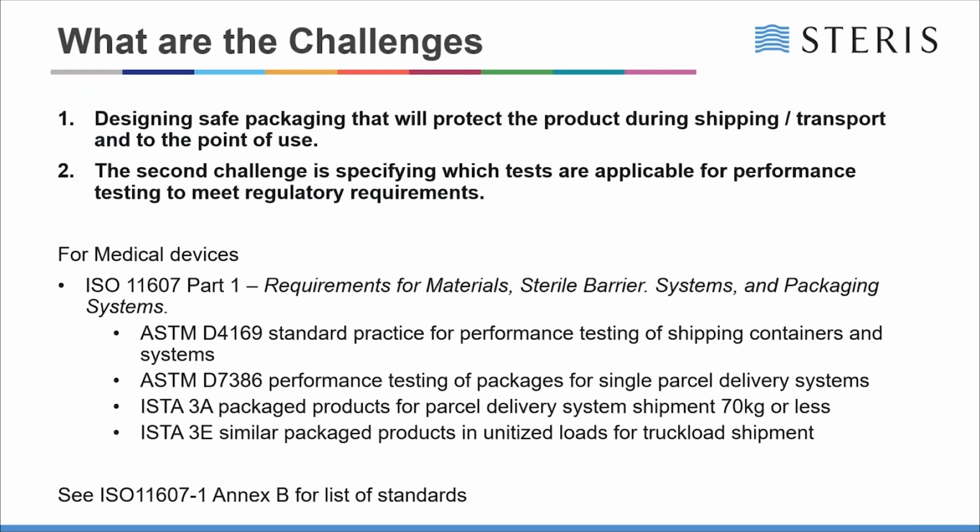The second challenge is in specifying which tests are applicable to the performance of this testing to meet the regulatory requirements. Typically, what's used for medical devices is ISO 11607, Part 1, and within that you have Annex B, which outlines there's 123 standards listed in there.